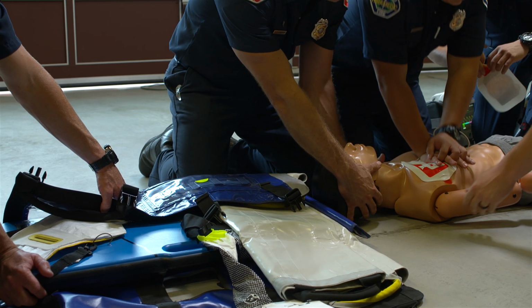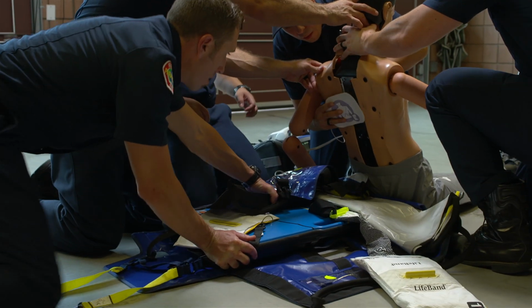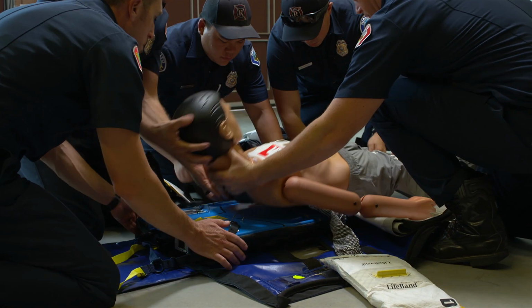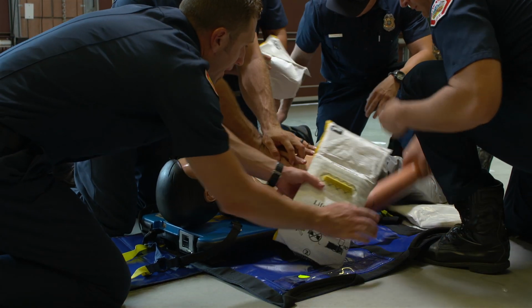Prepare the pads, the defibrillation pads, so that this happens, the time off the chest is very short. They will then sit the patient up, stop compressions. We want to limit this time. Slide the AutoPulse underneath the patient, lay them back onto the AutoPulse.